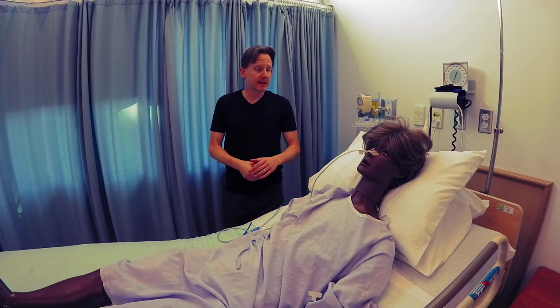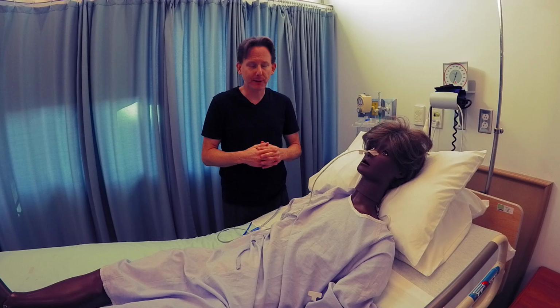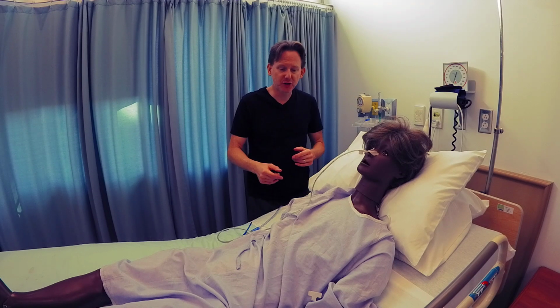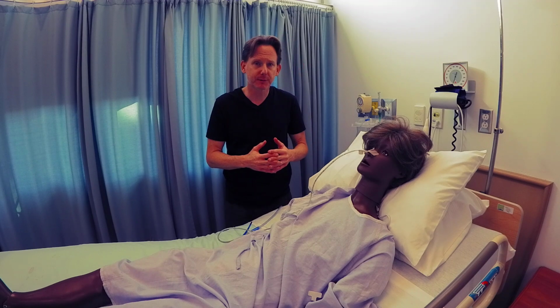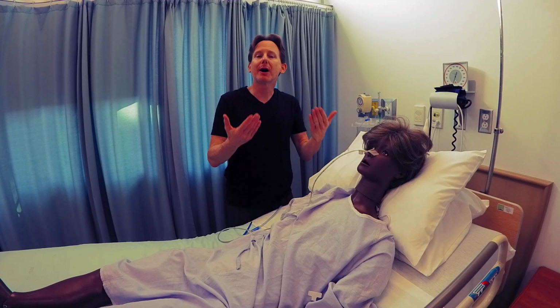In this video, we're going to take a look at the nasogastric tube and associated assessments around it. So again, the purpose of the tube is to remove excess air and fluid from the stomach. So let's assume the tube is already in situ, and now we're just coming to do our assessment.